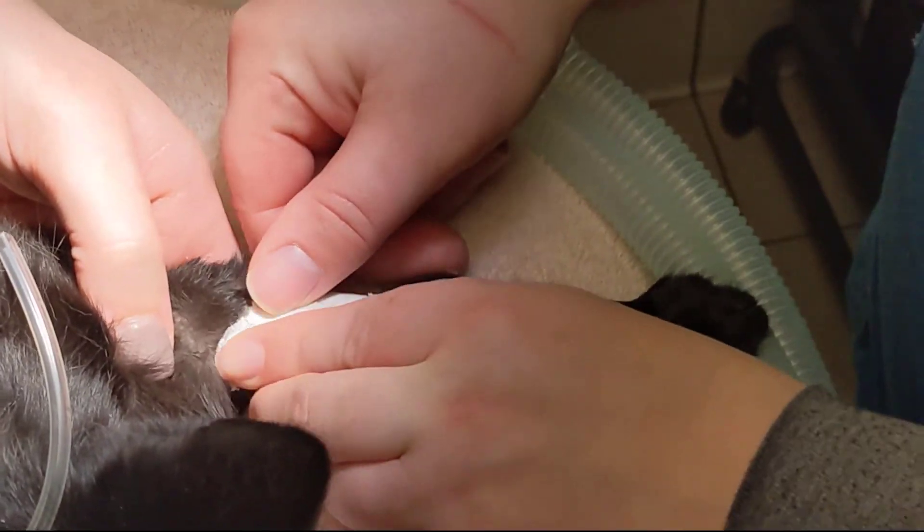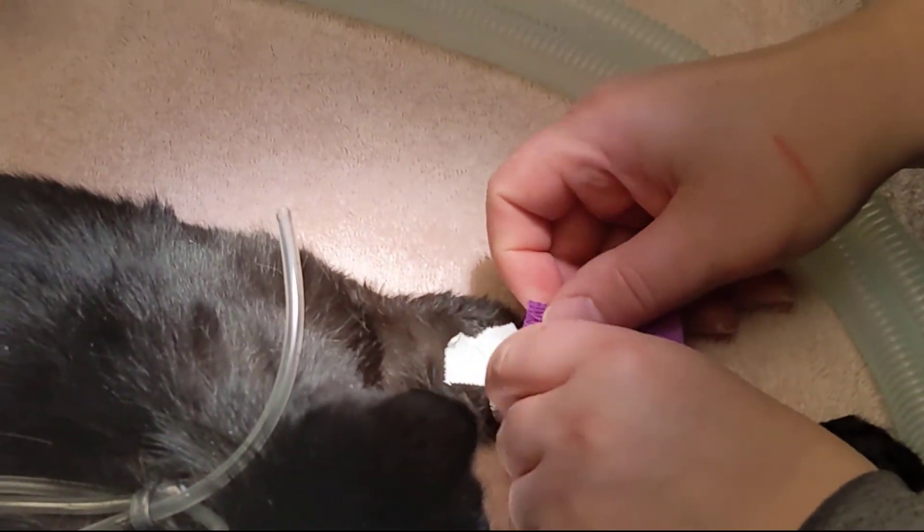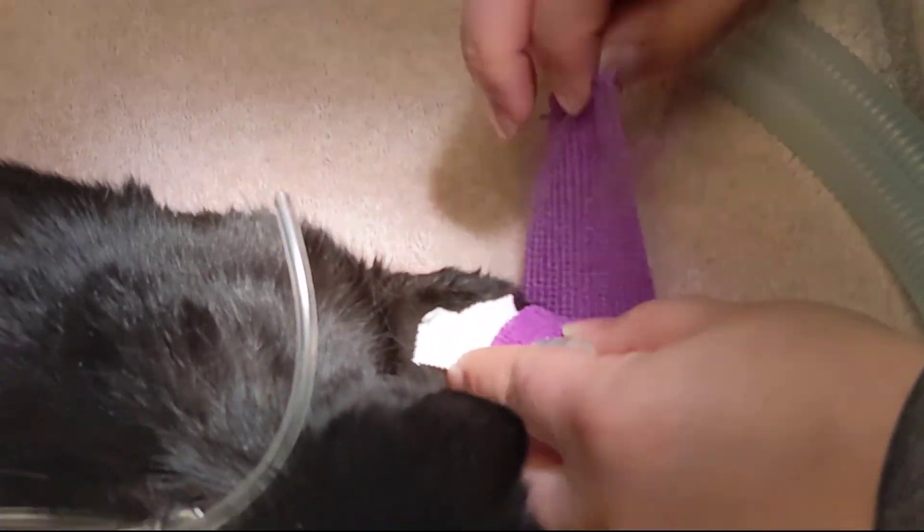If the catheter is not successfully placed, remove the catheter and try again farther up in the vein or on the animal's other front leg.